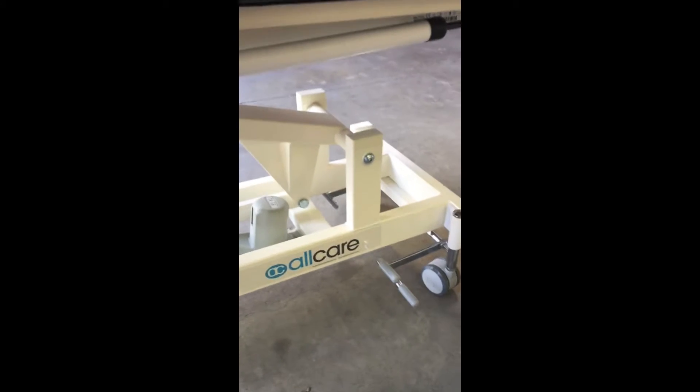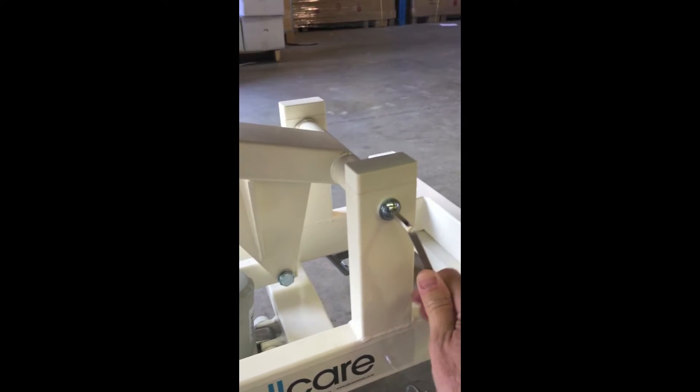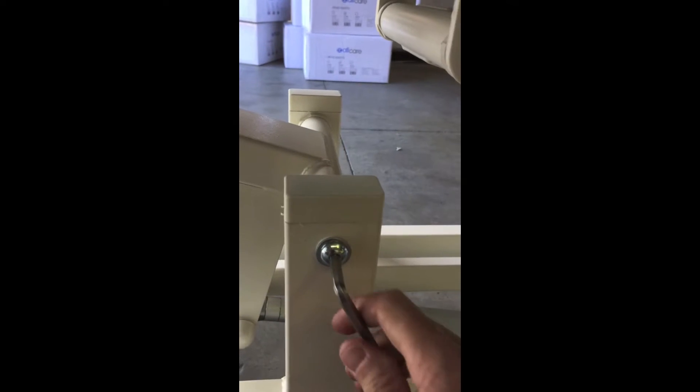Tightening the top frame. This is a simple process involving tightening the four pivot point connections between the base frame and the top frame using a 6mm Allen key. There are four pivot points on each side of the bed, and both sides will require tightening.